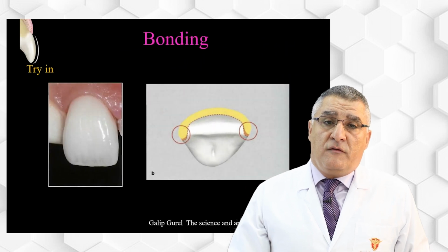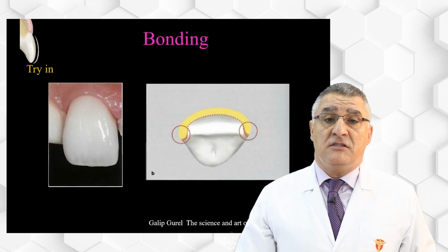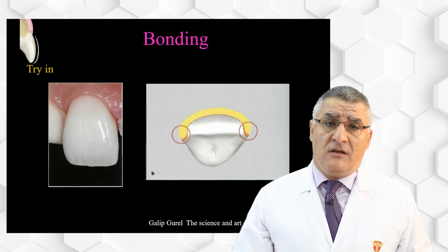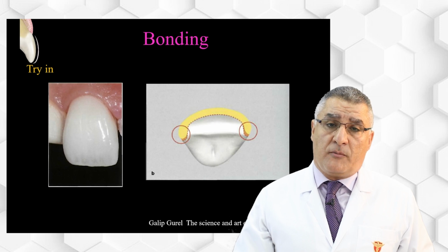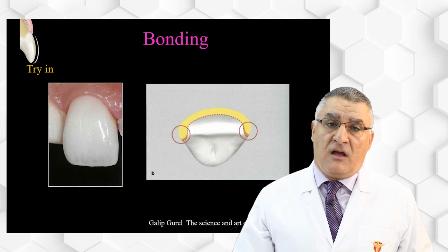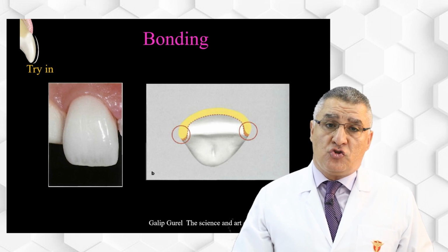After removing the temporary veneers, before bonding, we have to make a try-in for the veneer. First, we have to try it one by one and check the ceramic veneer using visual inspection to check the fit. Also, you have to check with a sharp explorer at the margin. You have to check they are fitted completely, with no gap between the veneer and the tooth.